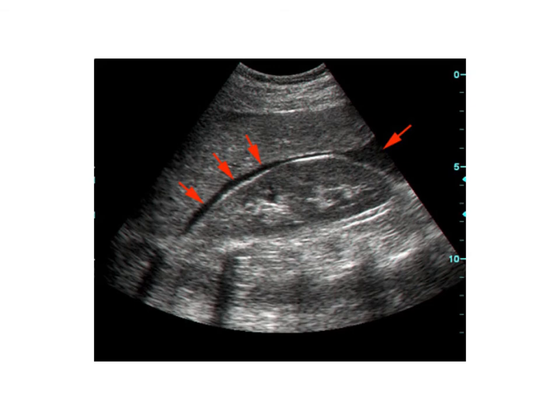This is another sample. You can see that in this case there is hemoperitoneum. It's this kind of fluid, this anechoic area, the black area. Remember, anechoic or hypoechoic means fluid in ultrasound language. So let's continue moving.